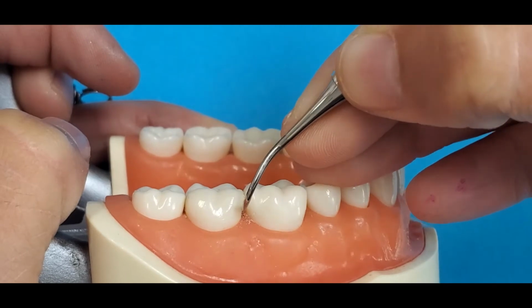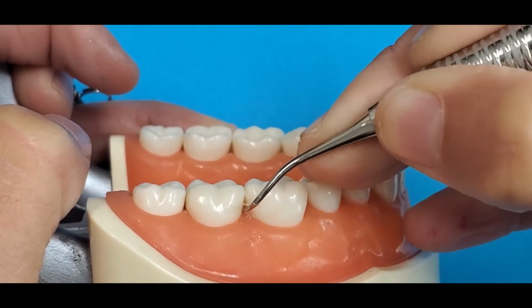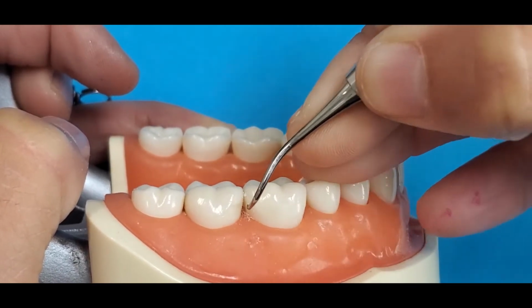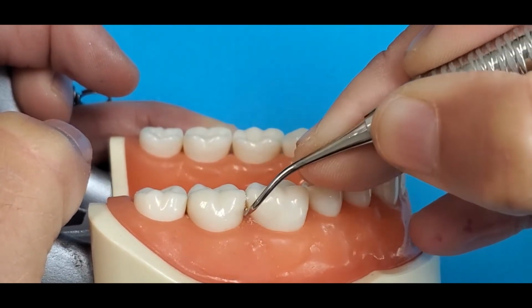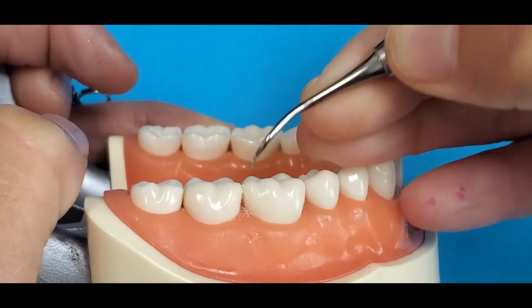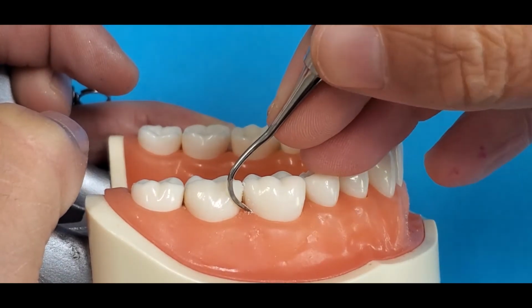You should have wrist motion and your stroke should go towards the tip and towards the tooth. Directional pressure. If you apply a stroke just straight vertical, you can hear the difference and you won't be successful at removing that deposit. You then need to reinsert distal line angle.